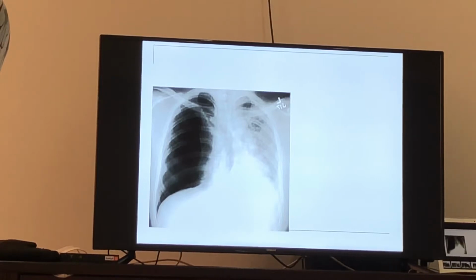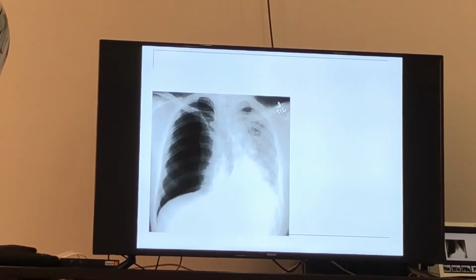What about this? We can measure the right. The left... the right can do. Yes, right side. So is the pathology right or left? Right. Good. Who said right? Pneumothorax. Yes. You need to stay together on this. So yes, the pathology is on the right.